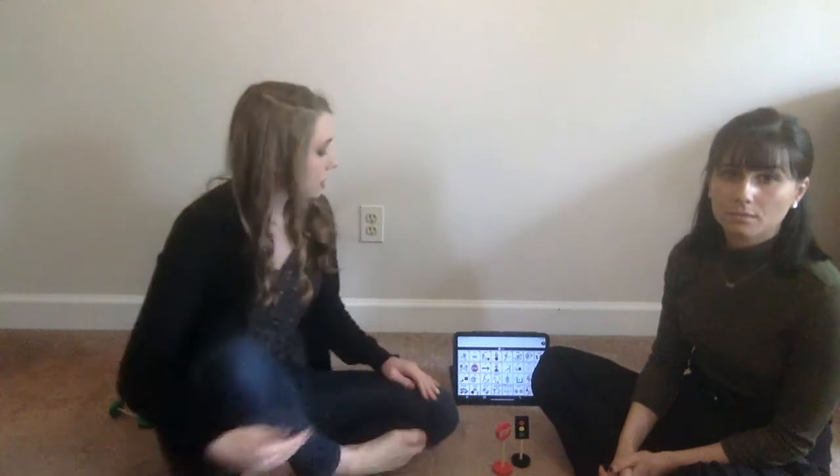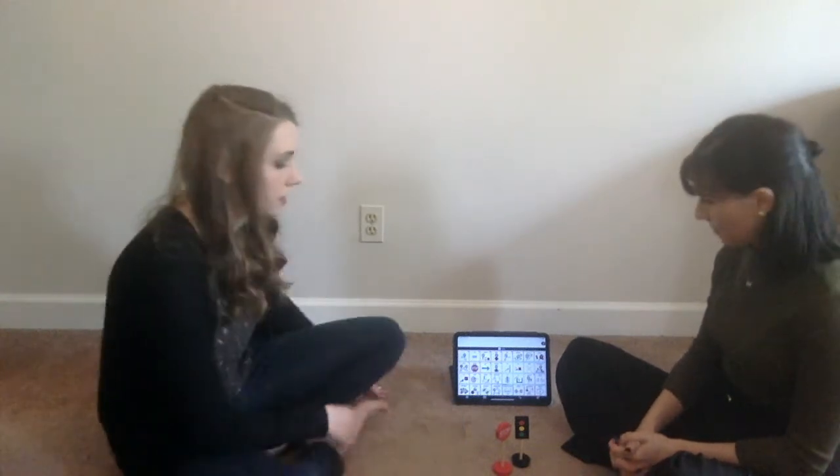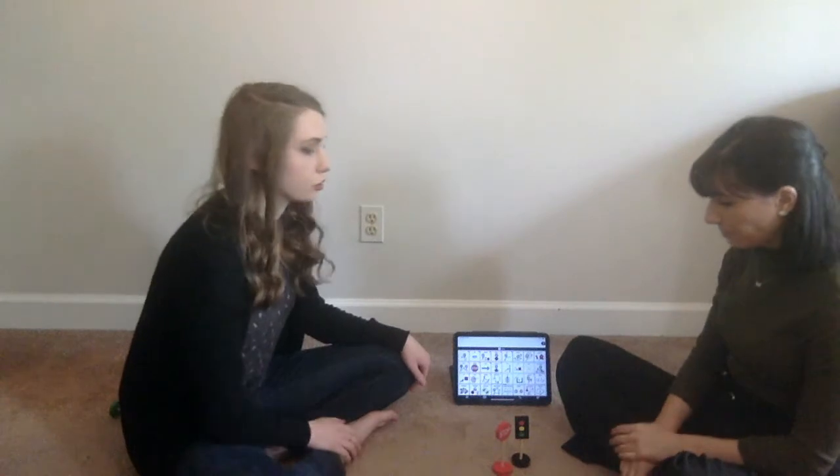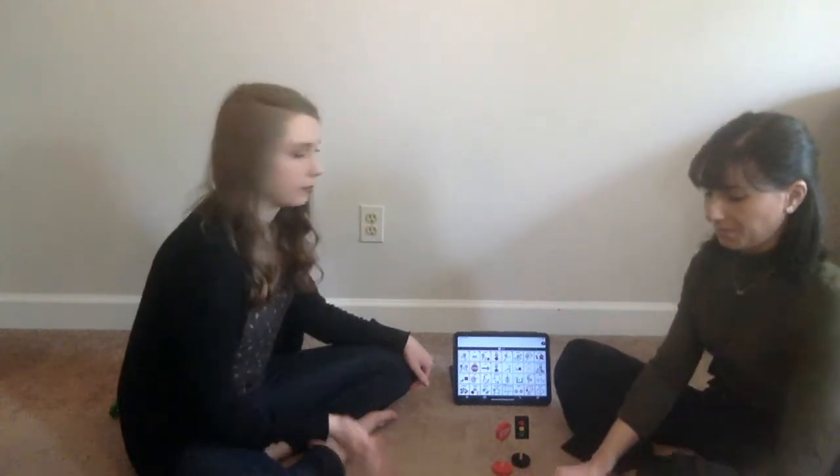Nice job. Now we're going to show you how you can use the device to model if you do not have a communication board. So I'm going to be touching the device while Alyssa is playing so that she can see what I'm doing. And then I will point to it so that she can choose the buttons herself to teach her how to comment and ask questions. So we have some toys in our unstructured play right now. Alyssa is playing with the toys, and I'm just going to talk about what she's doing.